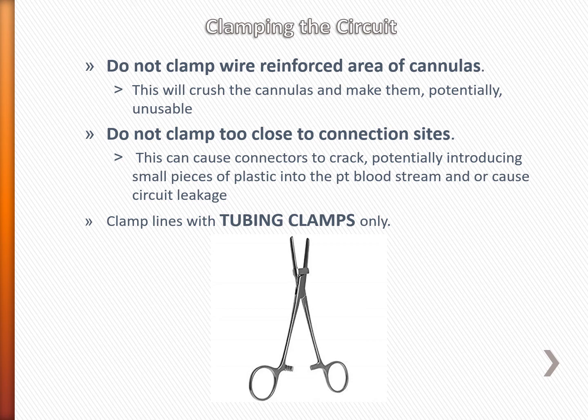The other thing is, do not clamp connection sites. Connectors are plastic, and if you break off a piece of the plastic, it becomes an emboli, which can seriously harm the patient. The other thing is the connectors could crack and the circuit could start to leak.